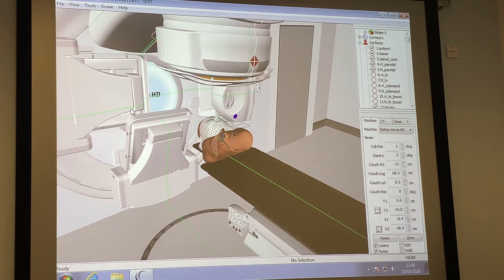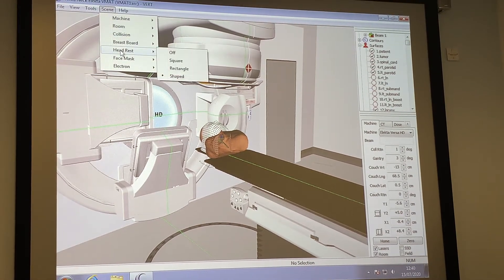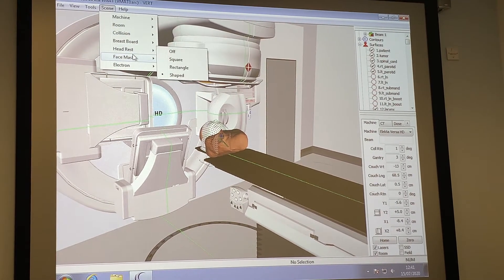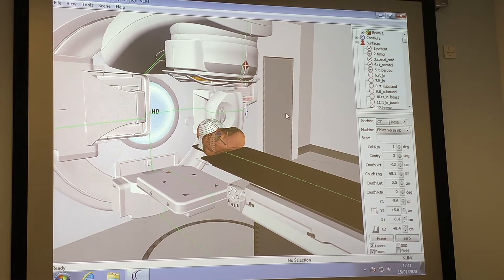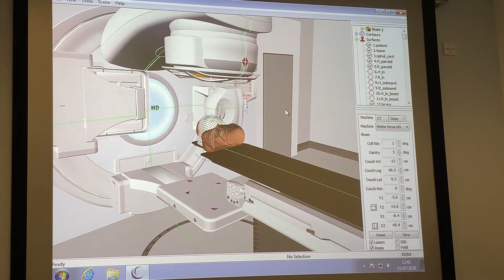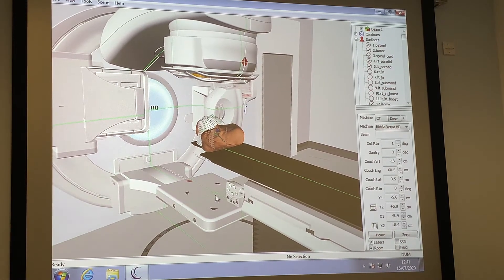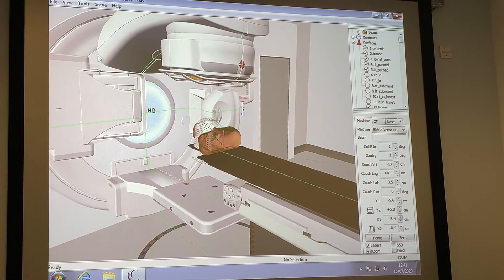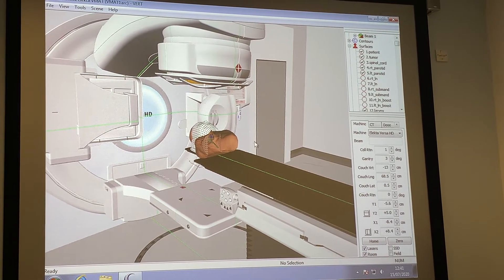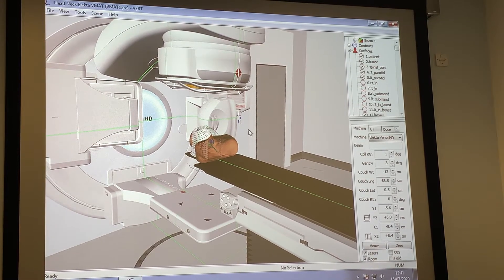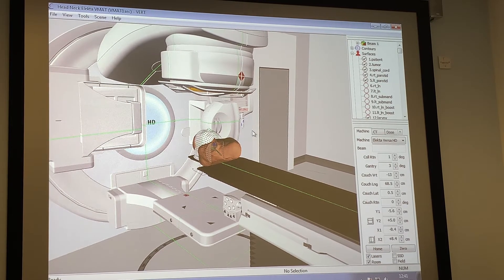To ensure the accuracy of radiotherapy, patients have images taken at the time of treatment to verify the accuracy. It can be quite a confining treatment. This is the image receiver — the intensifier. Patients will have different types of imaging: megavoltage imaging and also kilovoltage imaging, which means another panel coming out around them as it moves around their body in quite close proximity. All these aspects of treatment sometimes mean that radiotherapy can involve support services — play specialists, paediatrics, Macmillan support staff — to help patients who have claustrophobia and other issues coping with the treatment.